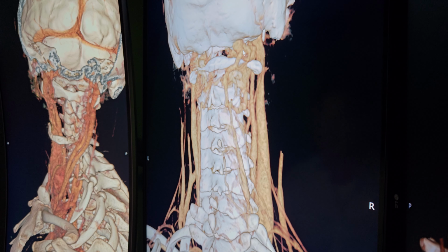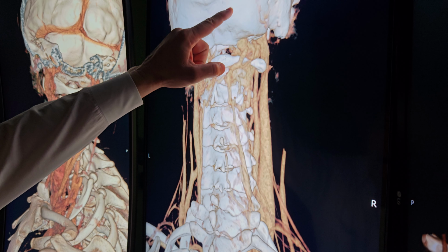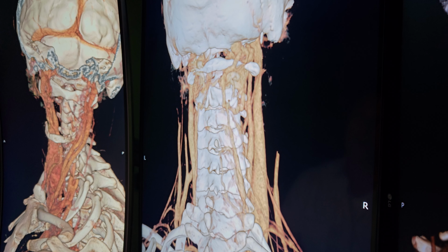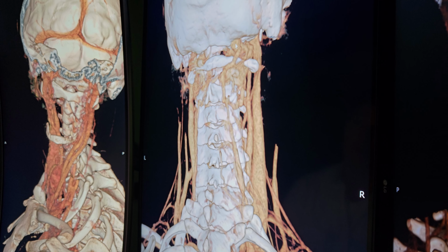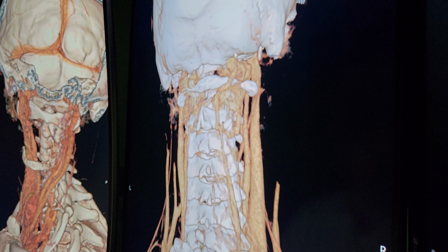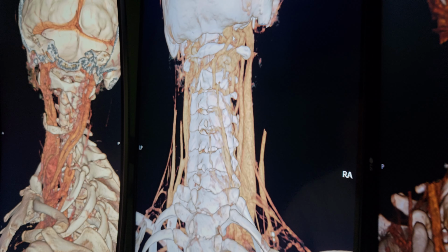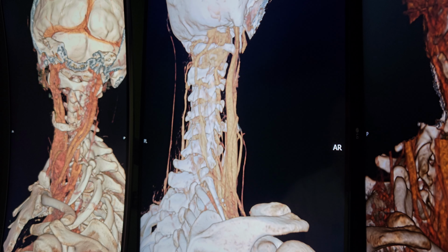One of the things we want to rule out is an AV fistula, to make sure the connection between the high pressure artery and low pressure vein is not compromised, and really it shows best on the arterial phase. But it looks like this might be inflated by high pressure. So they run a catheter up there to confirm if there is an AV fistula. So we would like that to be ruled out.